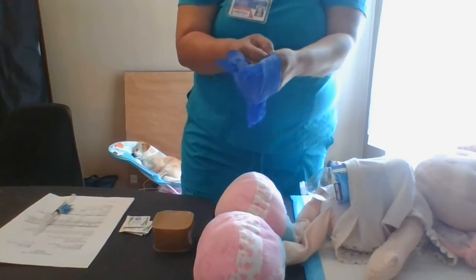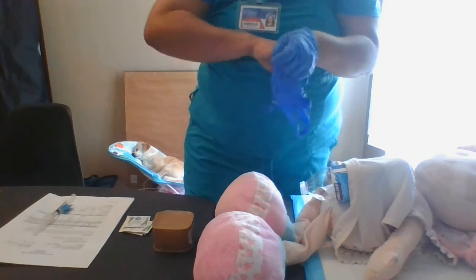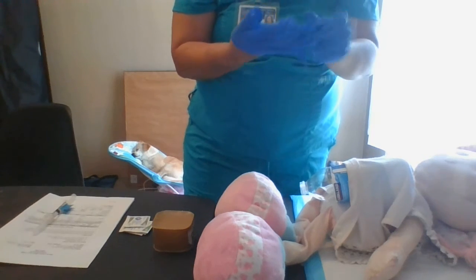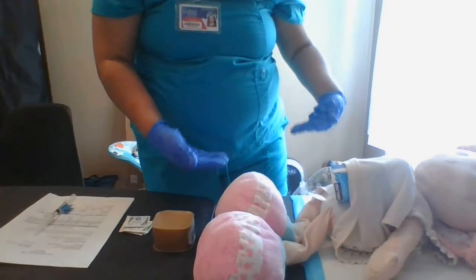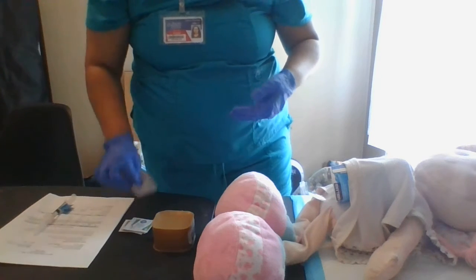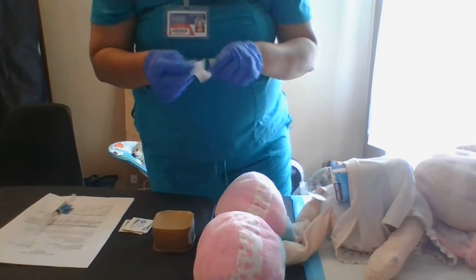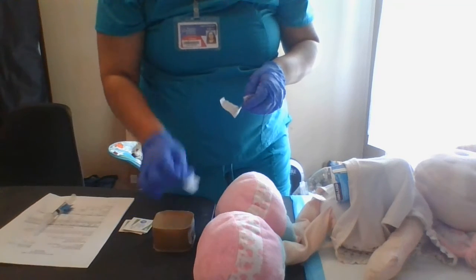Okay, I did hand hygiene and I'm putting on my gloves. I'm going at the outer aspect of my patient's arm. I will be giving this at a 45-degree angle. I have lifted my bed up to working level. I will now proceed to clean the outer aspect of my patient's arm and allow for it to air dry.